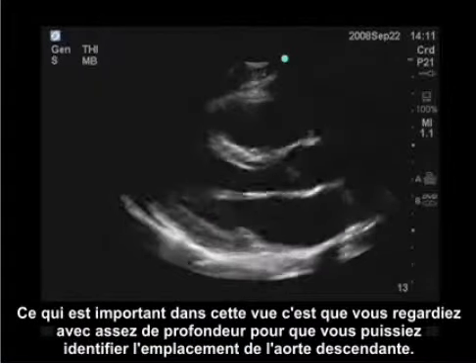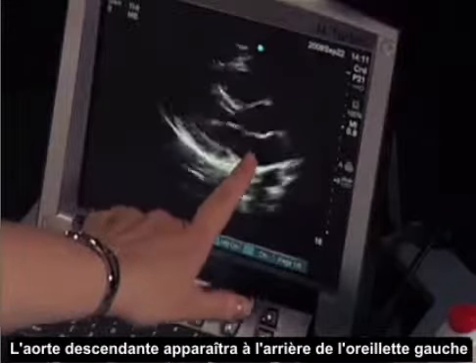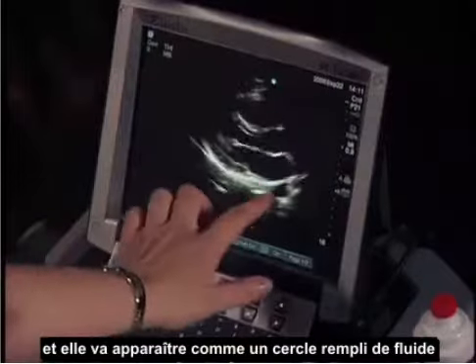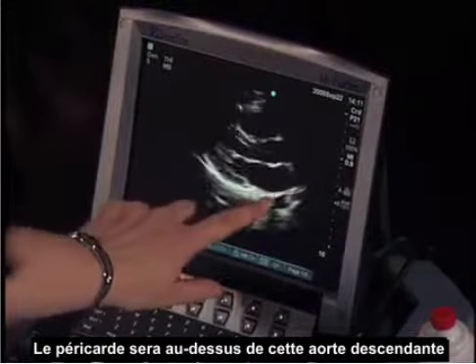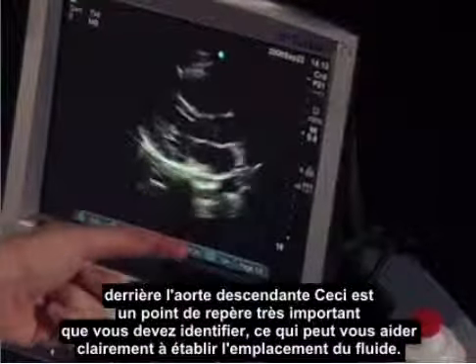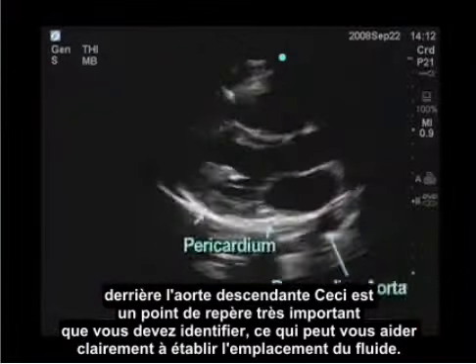What's important in this view is that you have it deep enough so that you can identify where the descending aorta is. The descending aorta is going to appear posterior to the left atrium, and we're going to see it as a round circle. If the fluid is in the pericardium, it's going to be above this descending aorta. If it's a pleural effusion, it's going to be behind the descending aorta. So this is a very important landmark that you need to identify so you can clearly establish where the fluid is present.